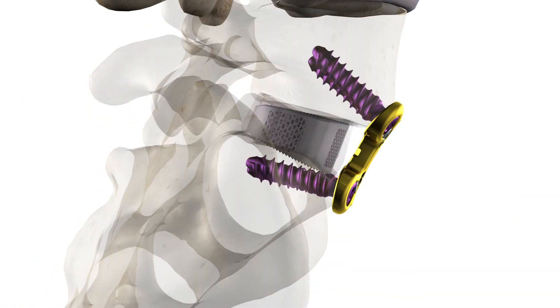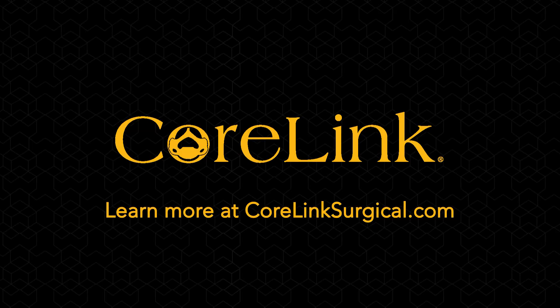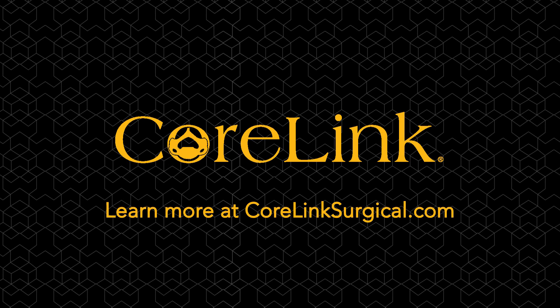This is the final imaging to show the placement of the system. To learn more, go to CoreLinkSurgical.com.